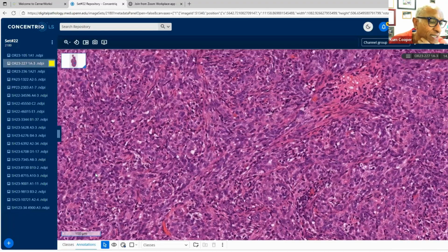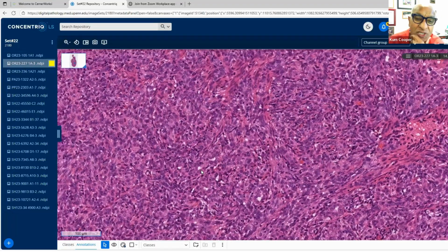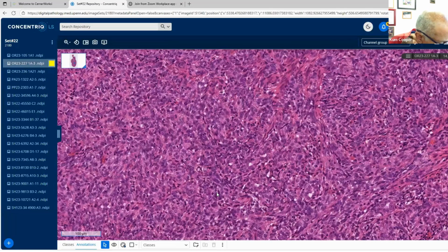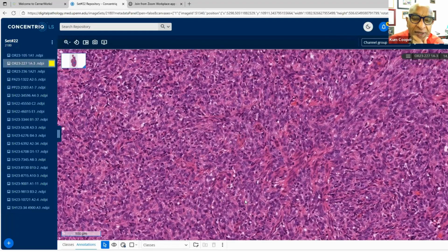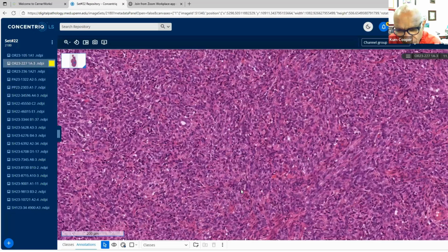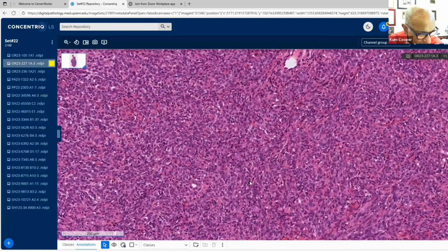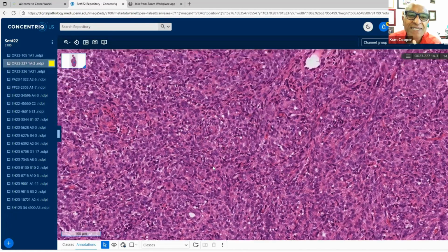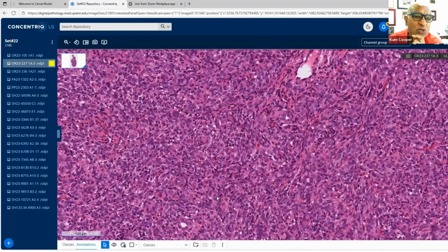I've got a third option here. Hi, Florence. Nice to hear from you. UTROSCT. You all know what that is: uterine tumor resembling ovarian sex cord tumors. And that's an excellent suggestion, given the heterogeneity of the morphology. I said there were cords and nests, and there were even glands. I've given you that mesenchymal, I've given you that keratin is positive. Would anybody else like any other markers on the suggestion of UTROSCT?